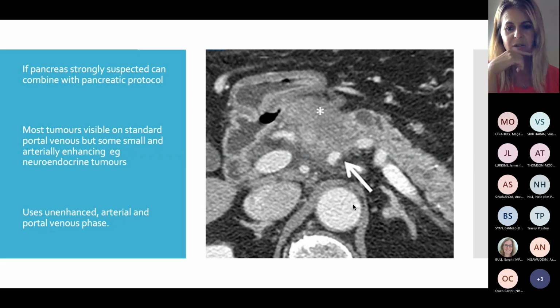The pancreatic tail upstream from that has duct dilatation within it, which is the sort of darker grey rounded bit within the structure to the right. And then there's also vascular involvement here outlined by the arrow, where there's a filling defect within the SMA.